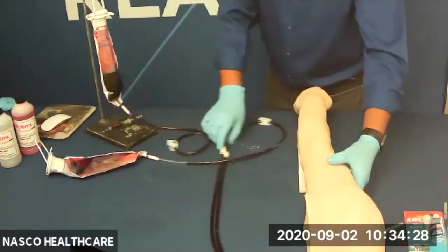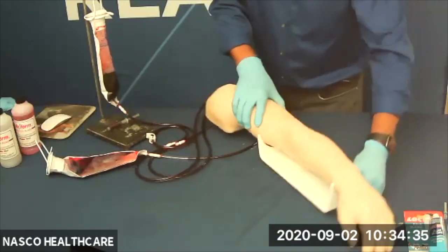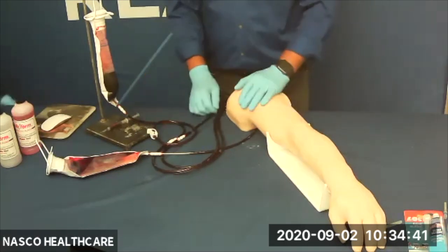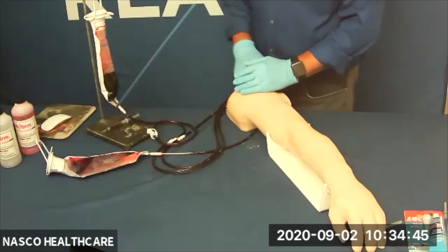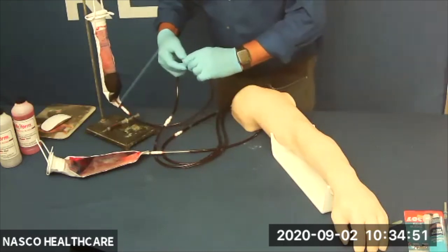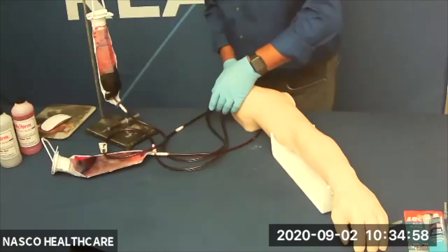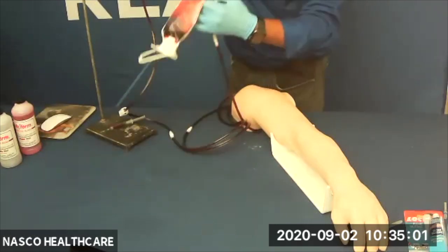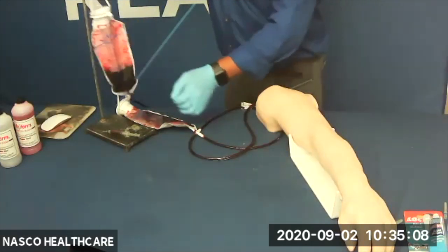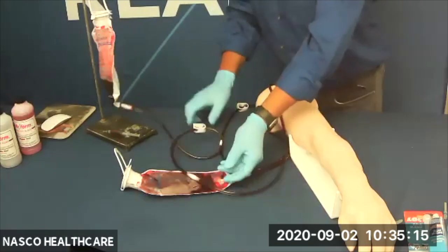When you are finished, you may pour the blood mixture back into the mixing container and absolutely reuse that mixture at a later time. Using the IV bags, flush the arm with clean distilled water and wash the outside of the arm with mild liquid detergent and water. Allow the arm and the veins to dry completely prior to storing. We do sell replacement skin and veins for this arm — they are available and extremely simple to replace.